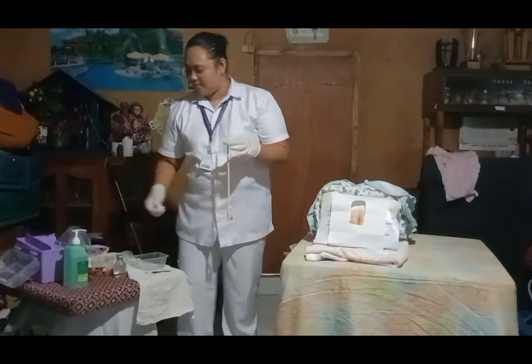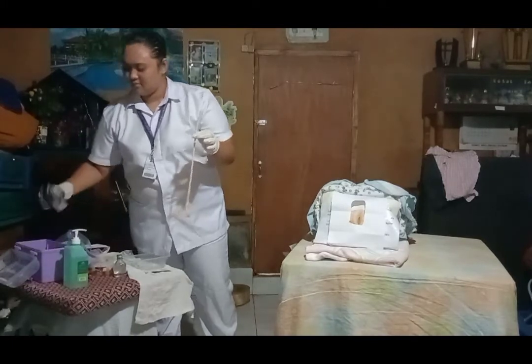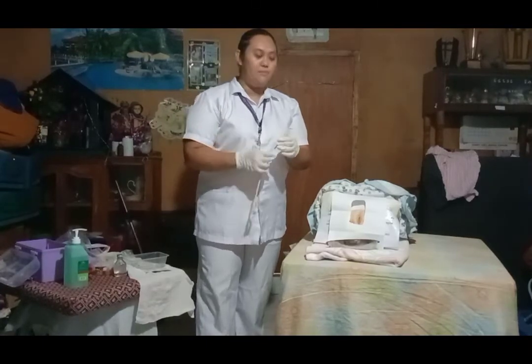So I'm going to place my tray here, and then pick up the catheter with one hand and place the other hand on the labia minora of the patient, separating the area surrounding the meatus.